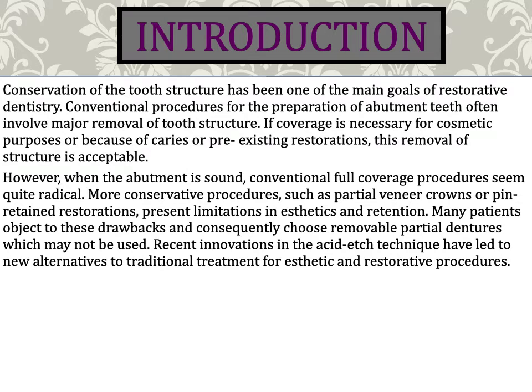So to introduce, resin bonded bridges are also called resin retained bridges, minimal preparation bridges, or adhesive bridges. Conservation of tooth structure has been one of the main goals of restorative dentistry. Conventional procedures for the preparation of abutment teeth often involve major removal of tooth structure. If coverage is necessary for cosmetic purposes or because of caries or pre-existing restorations, this removal of structure is acceptable.